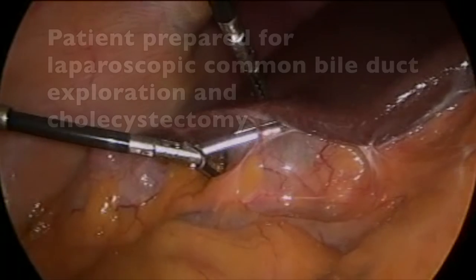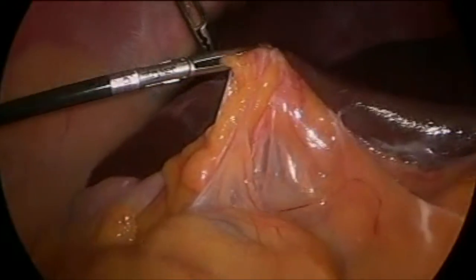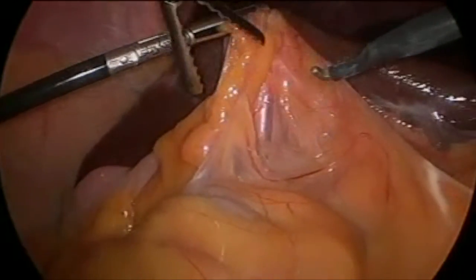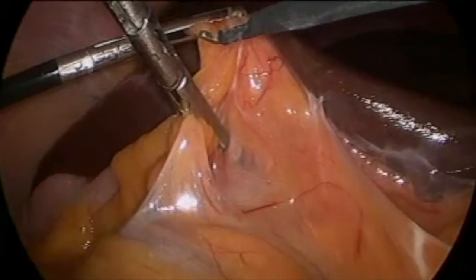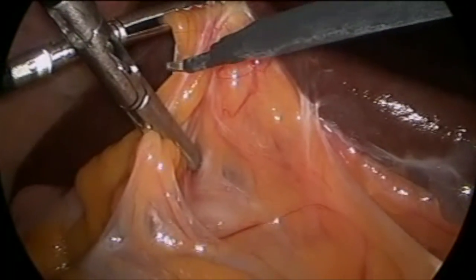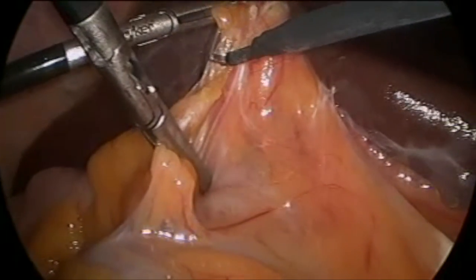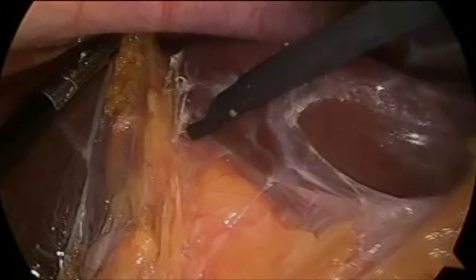He was consented for a laparoscopic common bile duct exploration and cholecystectomy. At the time of surgery, there were fairly substantial adhesions of omentum and the colon to the right upper quadrant and specifically to the liver. These were carefully taken down; care was taken to protect the duodenum and the colon.